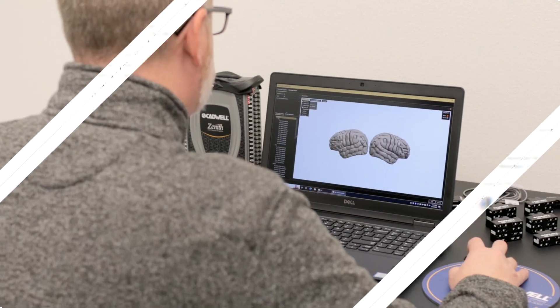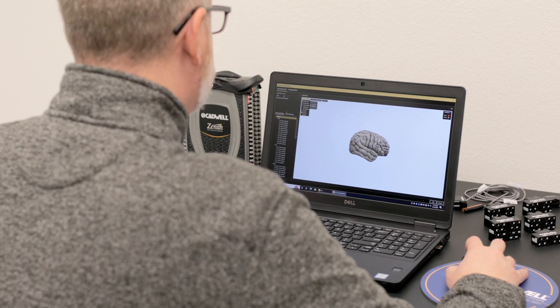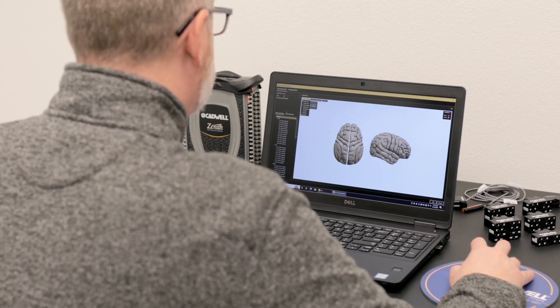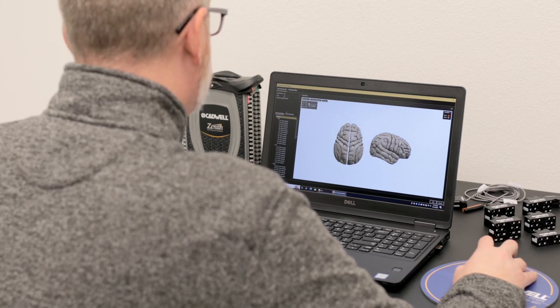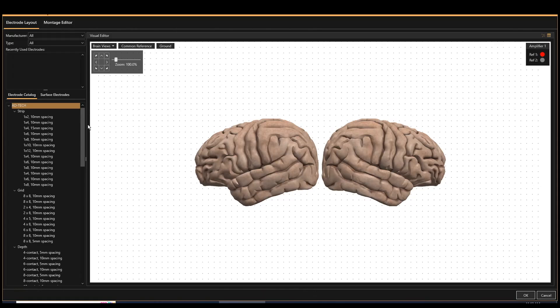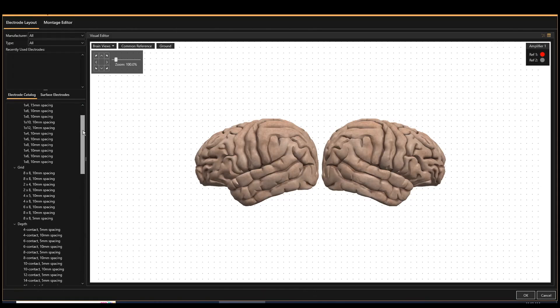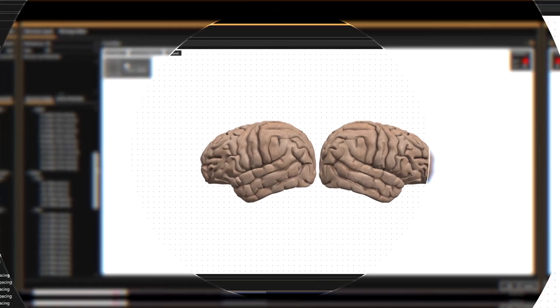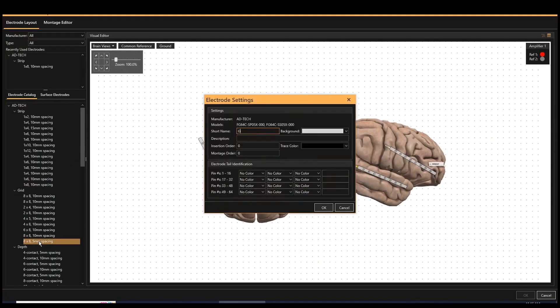Completely replace your paper electrode tracking and use ARC software on any computer to digitally recreate the neurosurgeon's electrode placement. Choose from a pre-loaded list of electrodes sorted by brand and type. Create a digital layout of the intracranial case in real time in the operating room on an acquisition PC or a laptop.